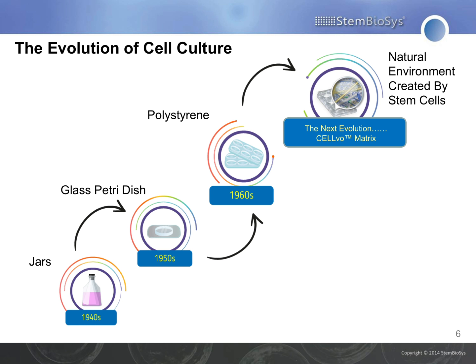The problem is, as I mentioned before, it's a very foreign environment. Cells, in most cases, have not seen polystyrene before in the body. And so once you start a cell culture on standard polystyrene, it's a very different environment for those cells. So what we're trying to do is change that.